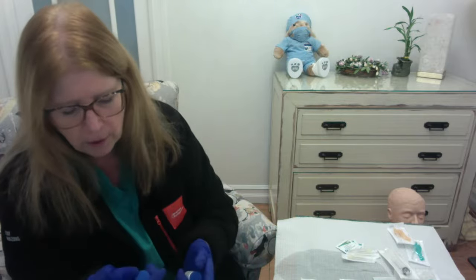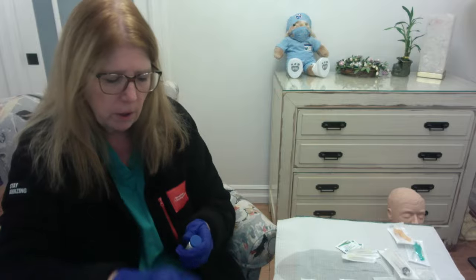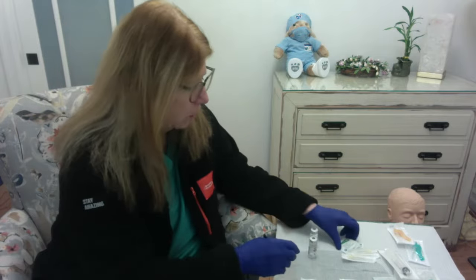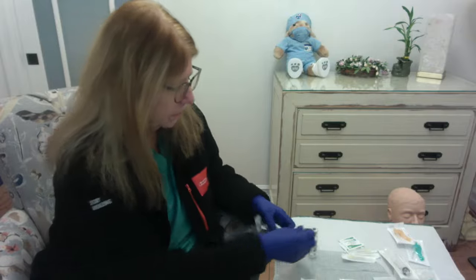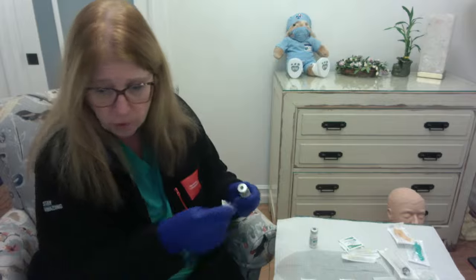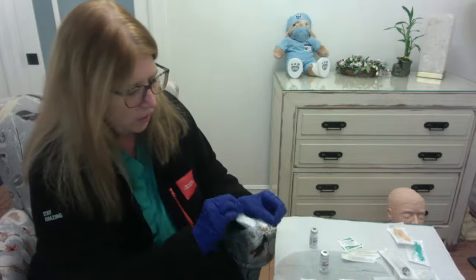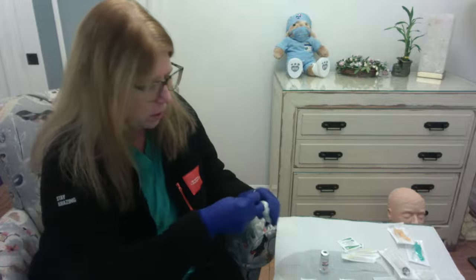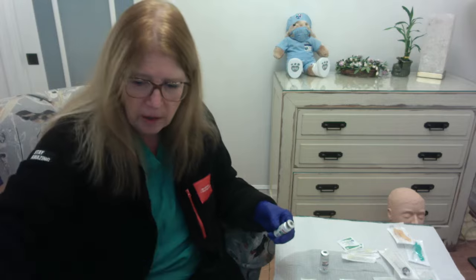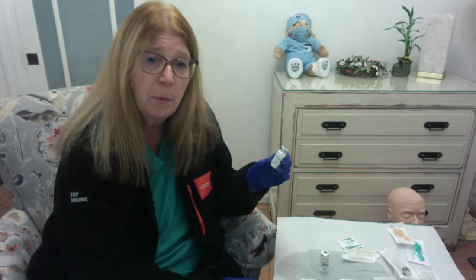So let's get started. I'm going to pop the caps off of both of these vials, okay? And then I'm going to clean both of them with some alcohol, okay? I'm going to do that 30-second scrub the hub. We'll say that that's 30 seconds. That's my first vial. My second vial, I'm going to do another 30 seconds to clean off that vial.